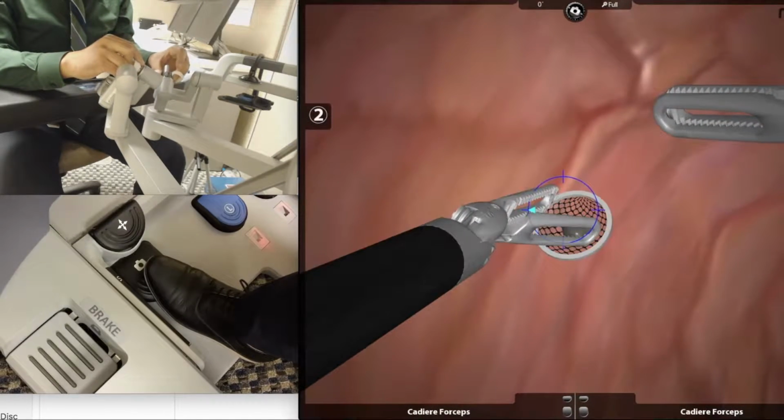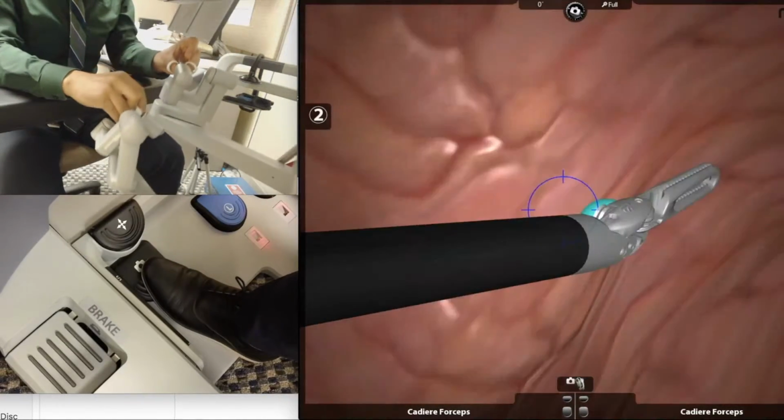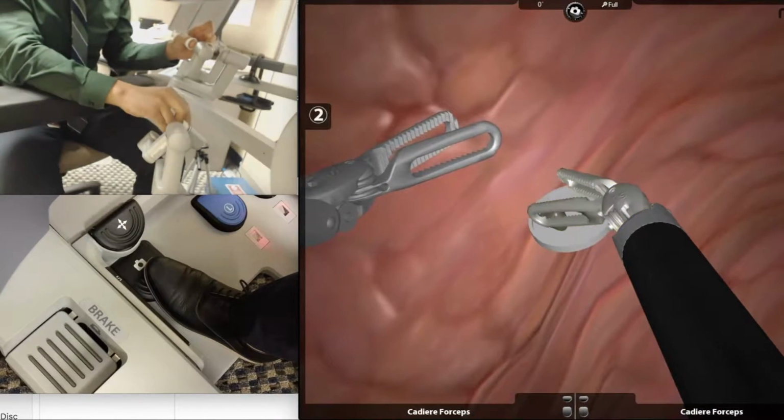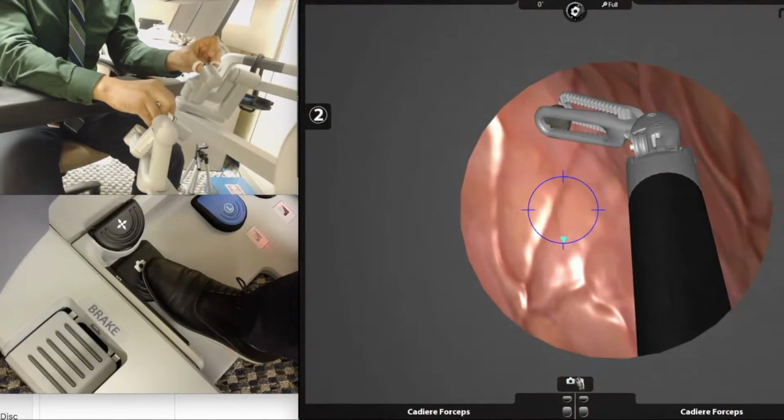Next is a clear example of moving your instruments out of the view of the camera, as seen in the right arm. The next mistake happens when you pull the camera far back into the trocar.